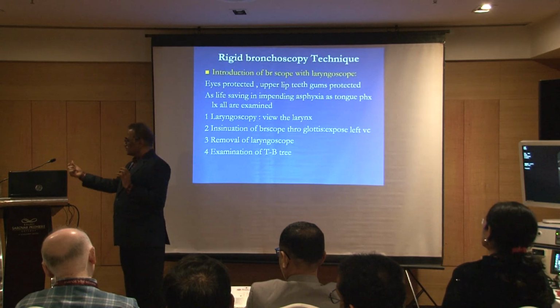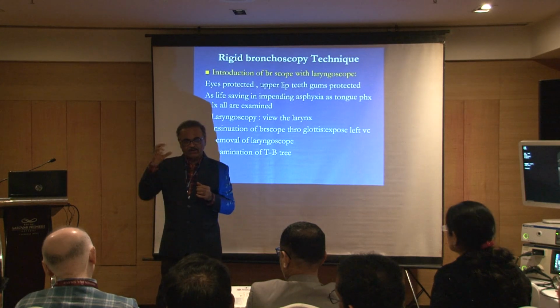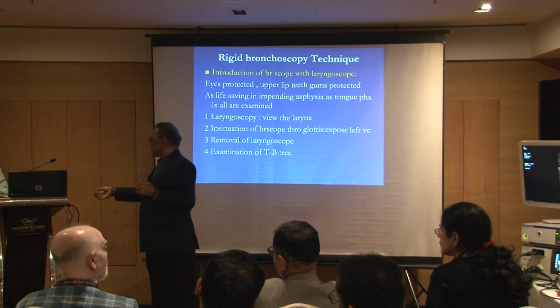Then afterwards, take the scope. Have the scope in the right hand, if you are a right-handed person. Then the bronchoscope.